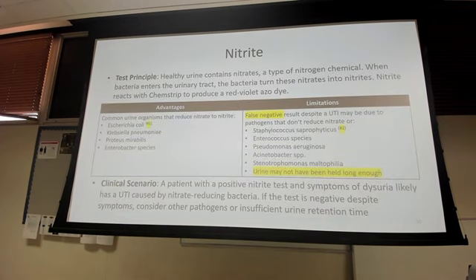All right, so nitrites, right? These are the common urine organisms that reduce nitrate to nitrite. So you have E. coli, Klebsiella, Proteus mirabilis, Enterobacter species. Right? And sometimes there'll be false negatives, and why do you think that is? Remember I was saying, if you don't get it to us in time, it's sitting around, what do you think is happening to it? It's breaking down, right? That bacteria, yeah, and growing in there, right? And so sometimes we'll have that false negative. Okay?